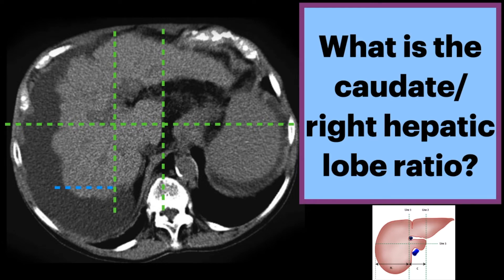The right lobe measurement is along line three from the right liver edge to line one. And lastly, the caudate measurement is along line three between lines one and two. From there, we can calculate the caudate to right hepatic lobe ratio.